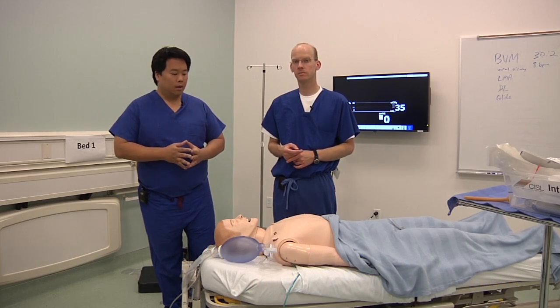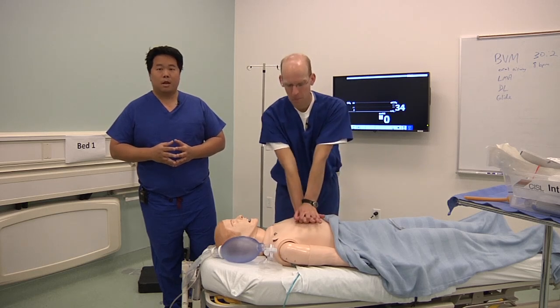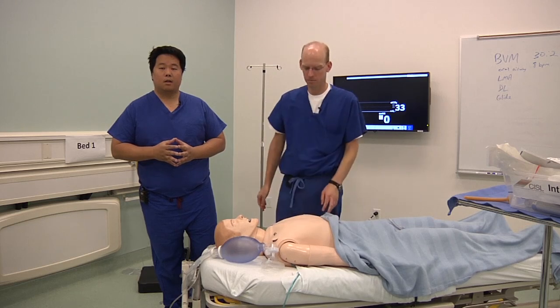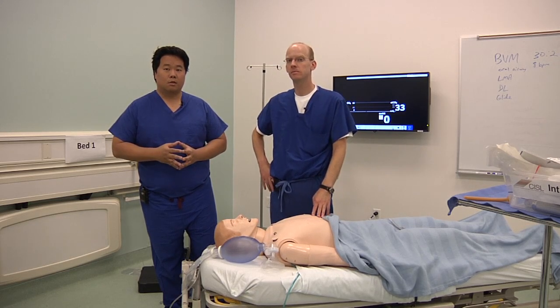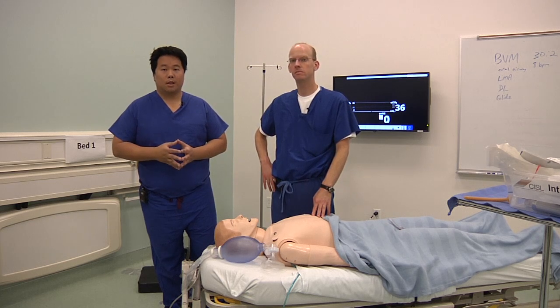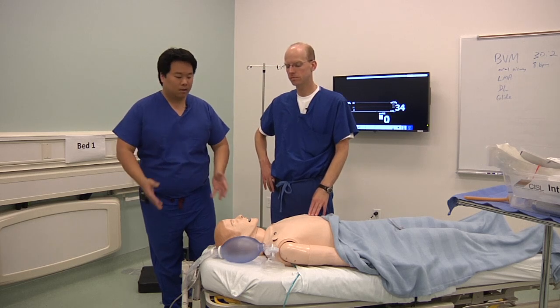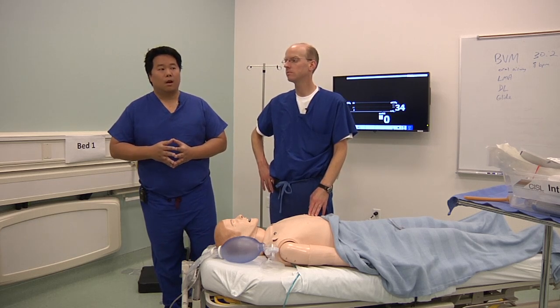This is so that you can aid the compressor. If you want to demonstrate, Kyle, how the bed position is now much more optimal for the compressor providing compressions for resuscitation. However, that comes at the expense of obviously the person managing the airway, because they're now much lower to the floor. The patient's not necessarily in the sniffing position, not necessarily towards the head of the bed.